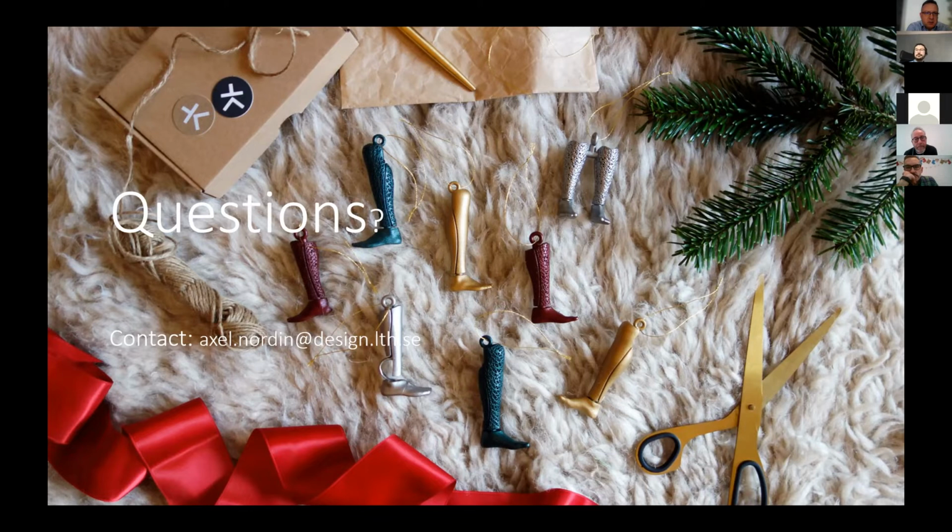I saw some also very interesting designs for production of prosthetics, not only for covering. So it's also a very interesting area for application of additive manufacturing. I don't have information about the durability of those types of prosthetics, but probably they are comparable with traditionally produced ones. This is only a presentation of covering in order to improve the self-confidence of the people who wear it.